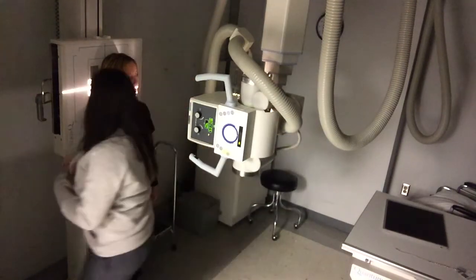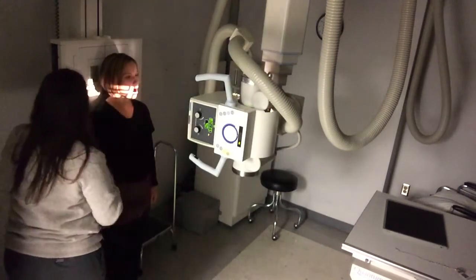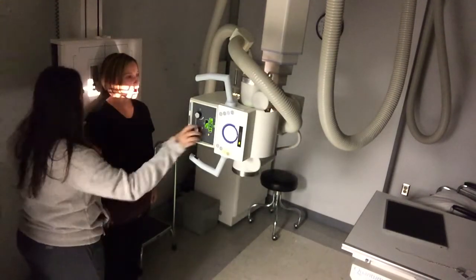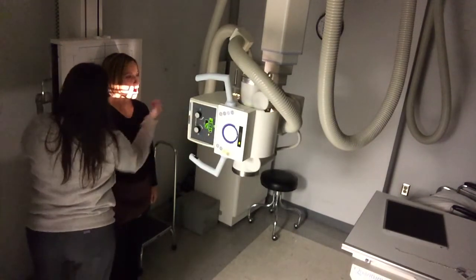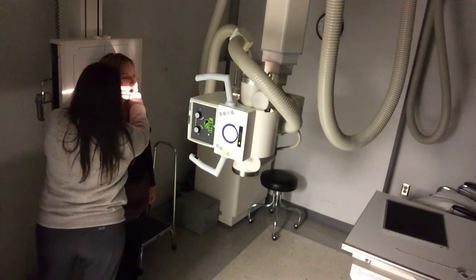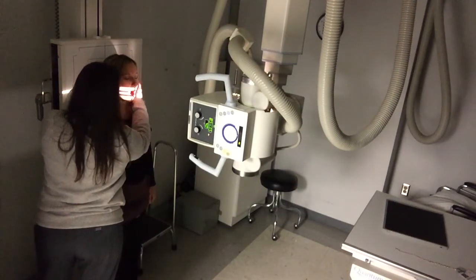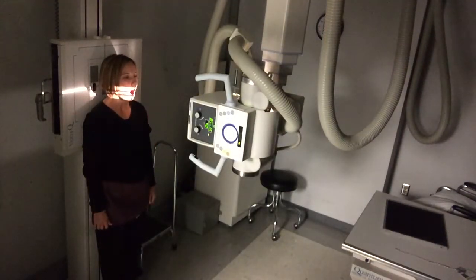I'm going to add a marker. You can mark either side, right or left. I'm just going to mark her right side out of convenience of it being on this side for me. I'm going to scoot her so that this line is right down her nose. And then now that I've got her here where I want her, I'm going to tell her to open her mouth as wide as she can. And I'm going to try to keep that orientation correct. Then I'll walk back, set 85 kVp, and expose.